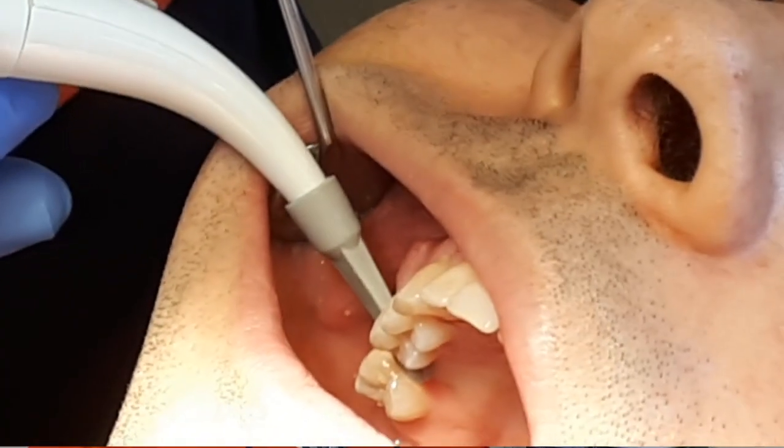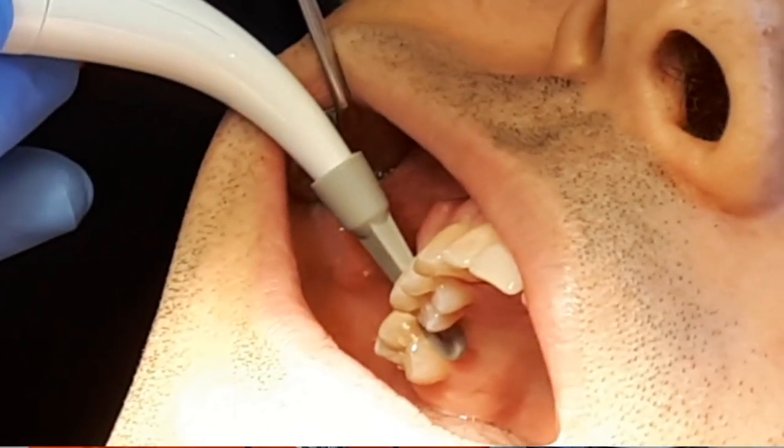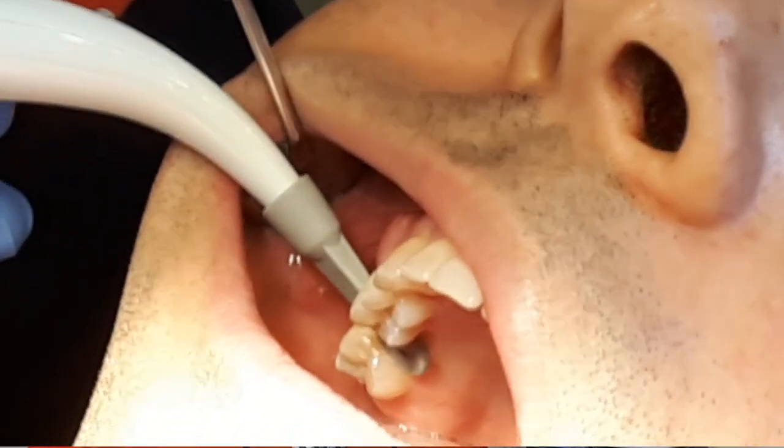The truth is that after I got the implant spotter, initially I was a little skeptical. I was thinking maybe it's just another gimmick or a dental toy, and we have many of those toys in our drawers.